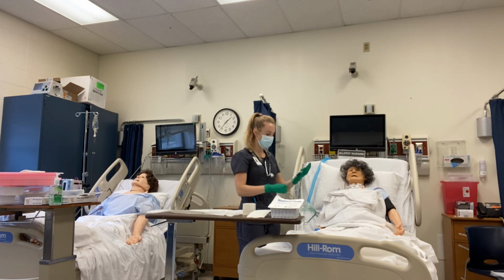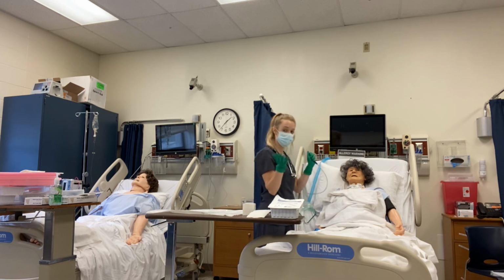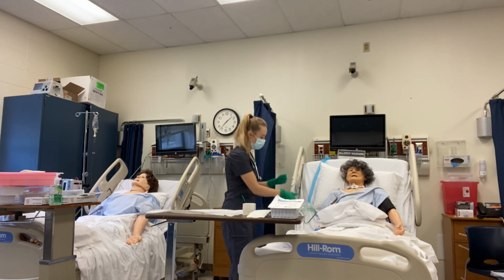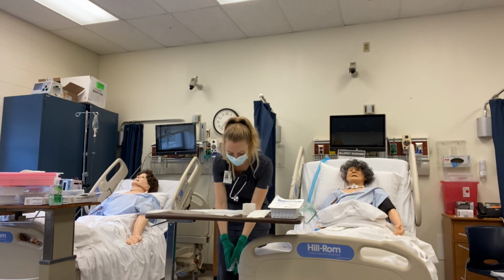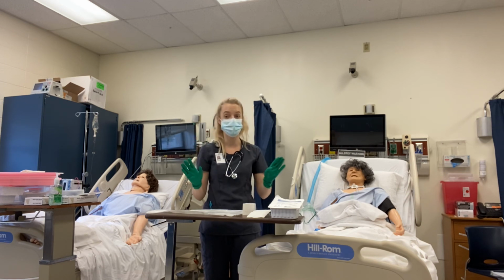I will wind the suction catheter in my glove. As long as I'm getting these gloves dirty, I'm going to go ahead and remove this soiled dressing, and then I'm going to wrap everything in my gloves and throw it away. For the sake of conservation, I'm not changing my sterile gloves, but I would here otherwise.